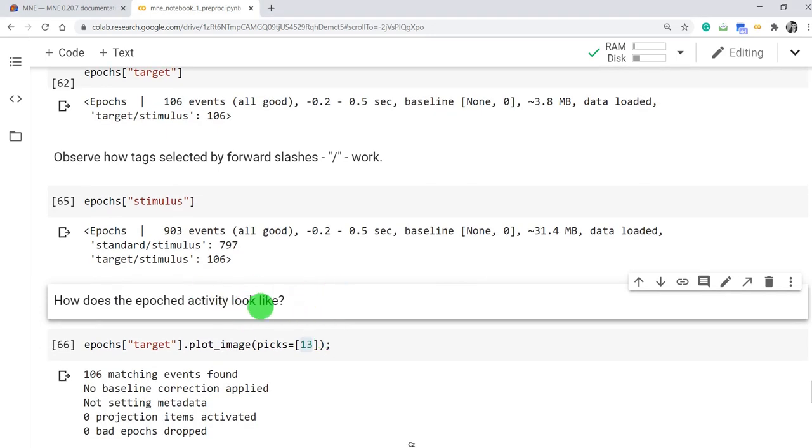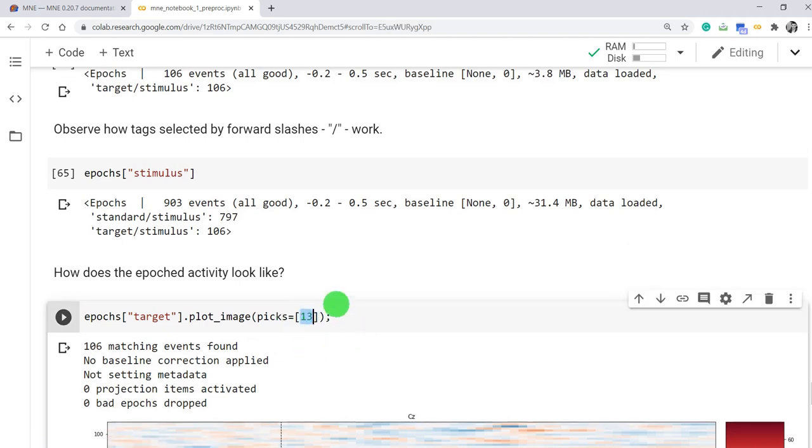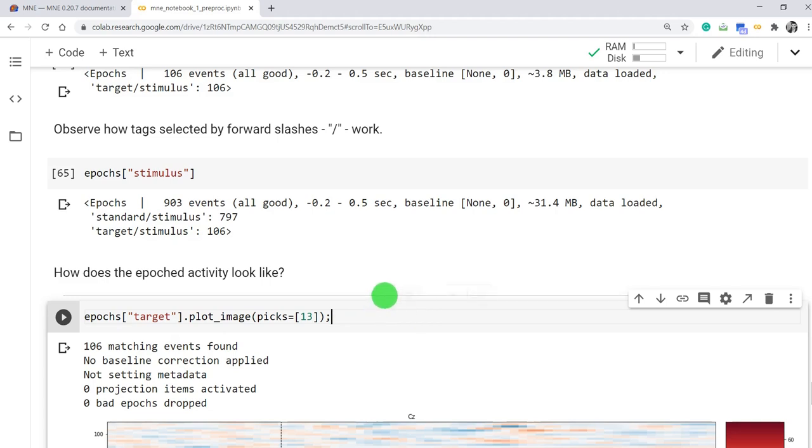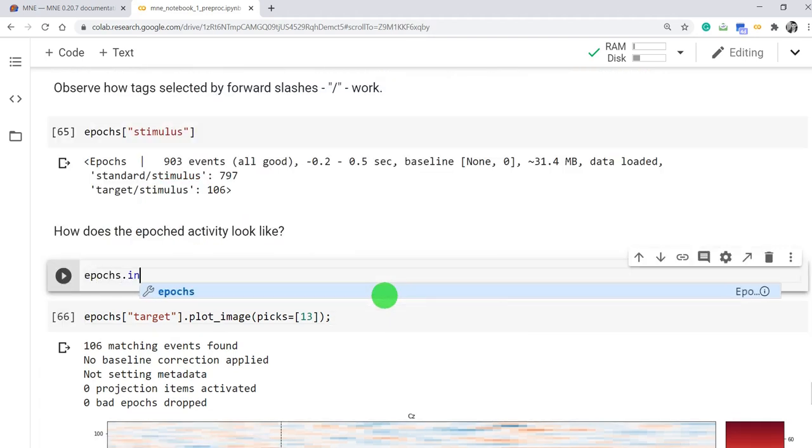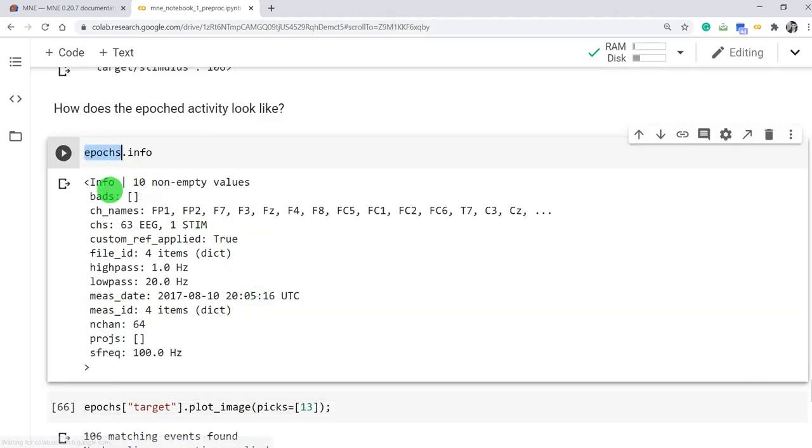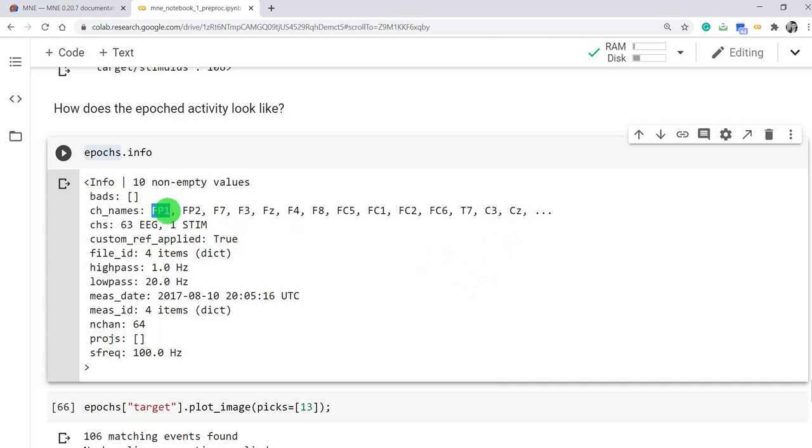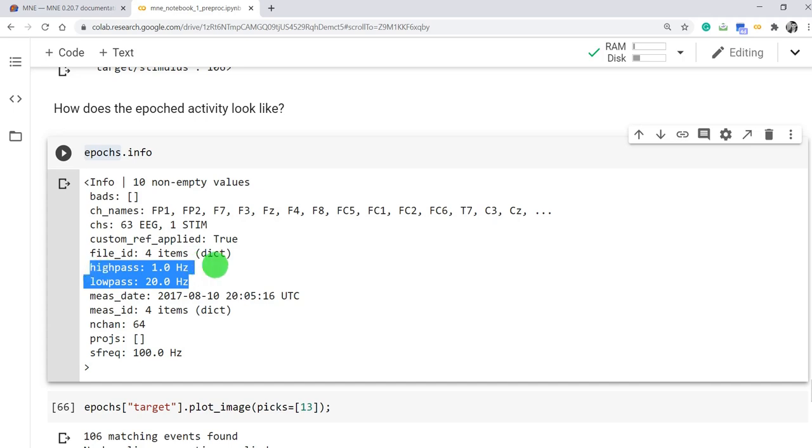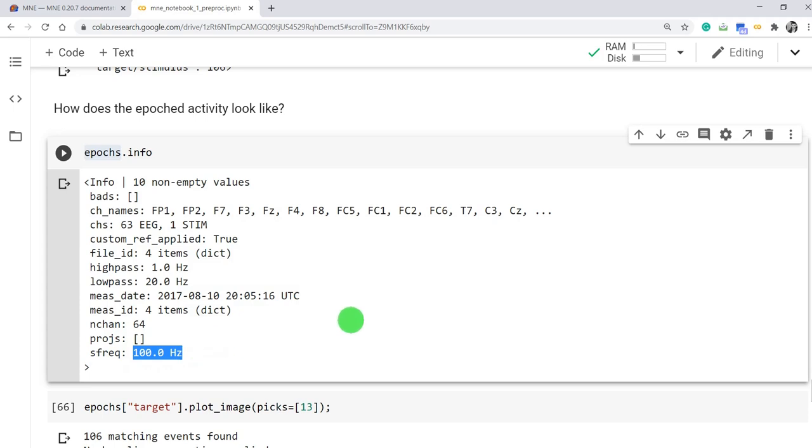How does the epoch ERP look like? The epoch activity look like after segmentation. We can pick one channel by the channel number ID. Channel 13 is our CZ channel in this epoch. Let's see. Epochs, first epochs info contains useful information about this object, including the channel names. 63 channels in total. So channel 13, 1, 2, 3, 4, up 13 here is identified CZ. First channel, FP1. And we have some other information regarding the operations have been done on this data. So for example, we applied a bandpass filter with the following cutoff frequency, 1 and 20 Hz. And also, the object contains the date when the data has been acquired and what kind of sampling frequency has been used in acquiring this data. 100.